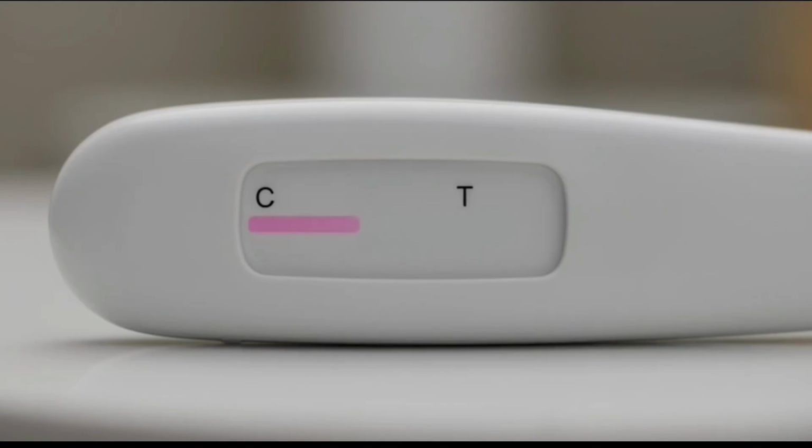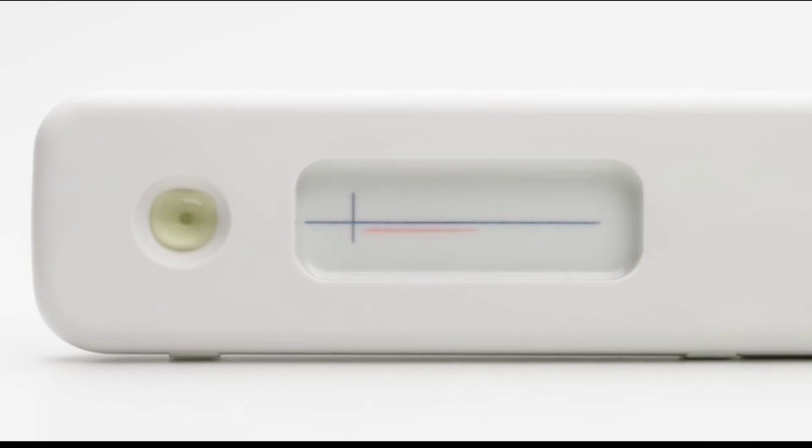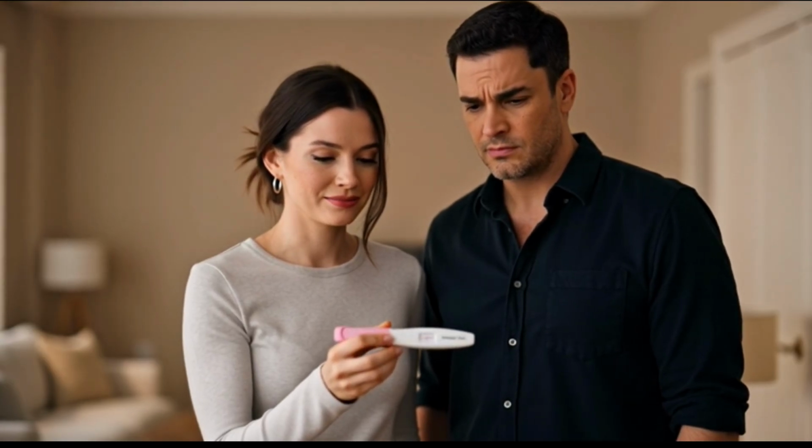Now let's talk about the best next step. If you see a faint colored line within the time window, wait 48 hours, then test again. In early pregnancy, HCG typically doubles about every 48 to 72 hours, so a true early positive should appear darker over time. This is where many couples regain clarity.